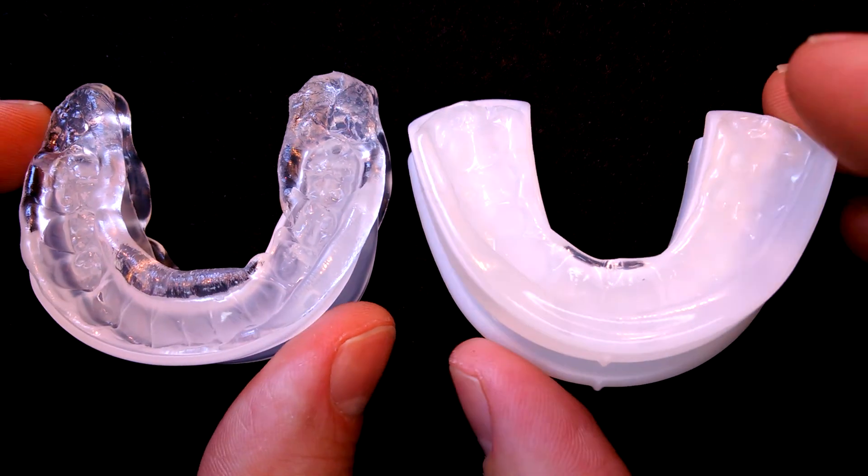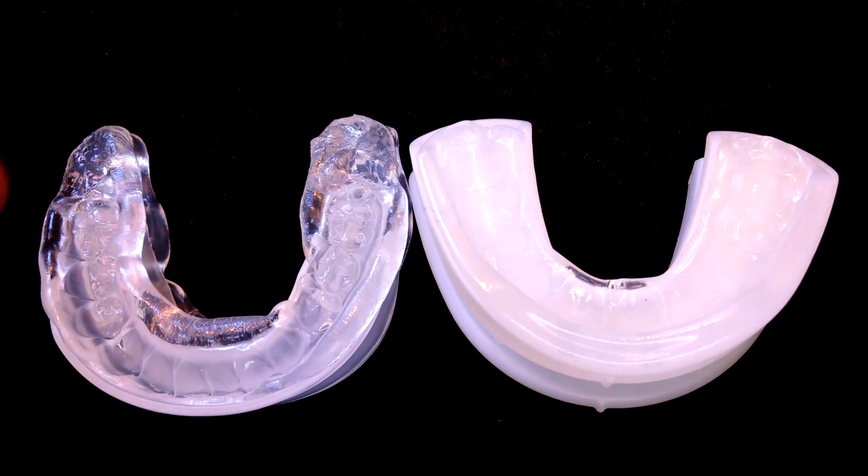That was my comparison video between the Sleep Pro Contour and the PureSleep. For more comparison videos, you can check out my YouTube channel or visit my website at snorermouthpieceguide.com.